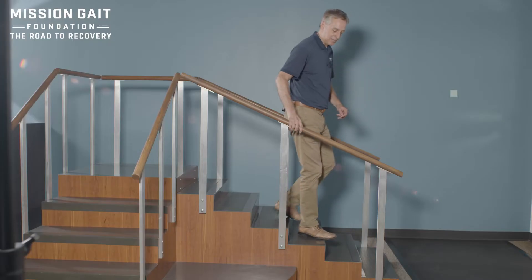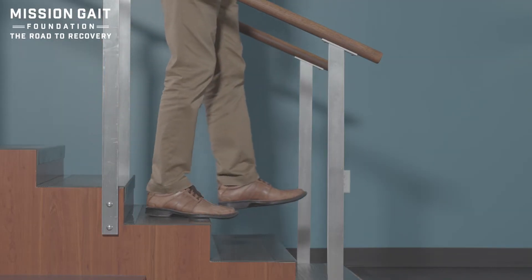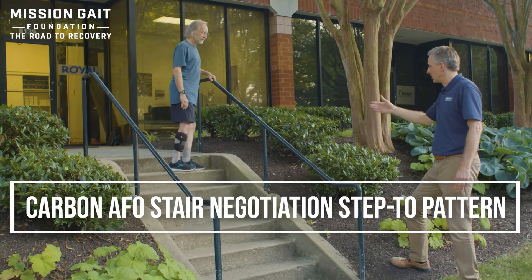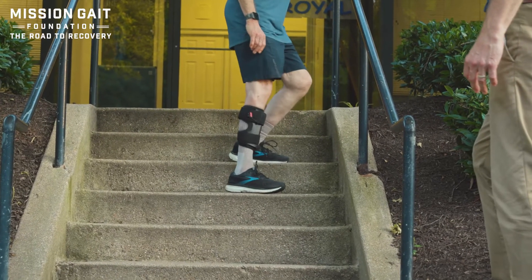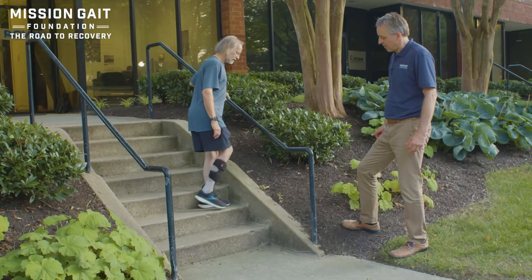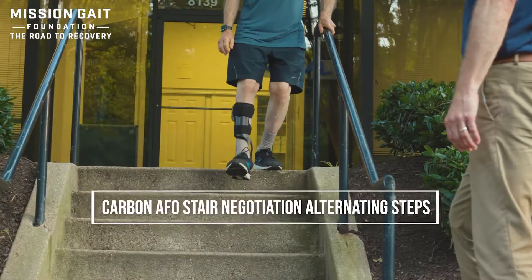One last time — coming down steps, I'm in a position where I'm going to hang that foot slightly off the step, stabilize, bring my weight forward, and come down off. So if you step out, give yourself room to lay your foot. Step on the outside for the support of the lateral knee, and then down that step with control. On the bottom step, you step out, turn, and you can walk away.